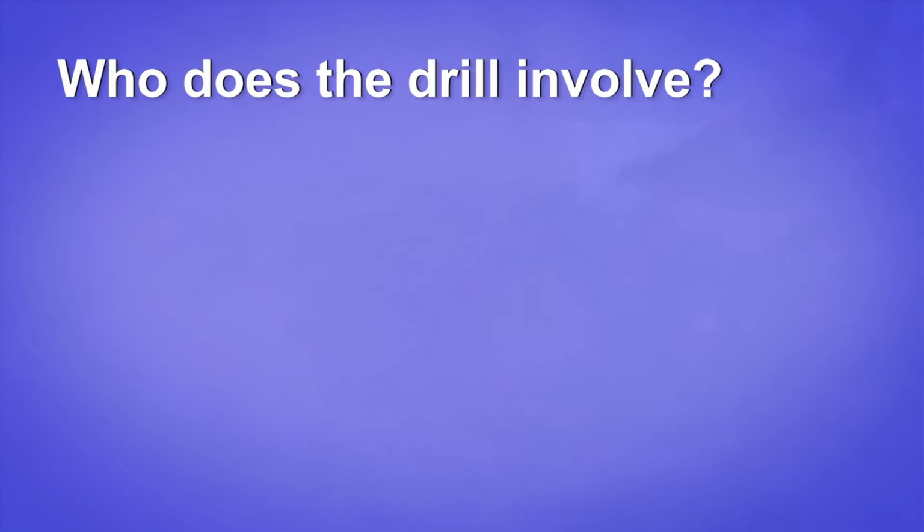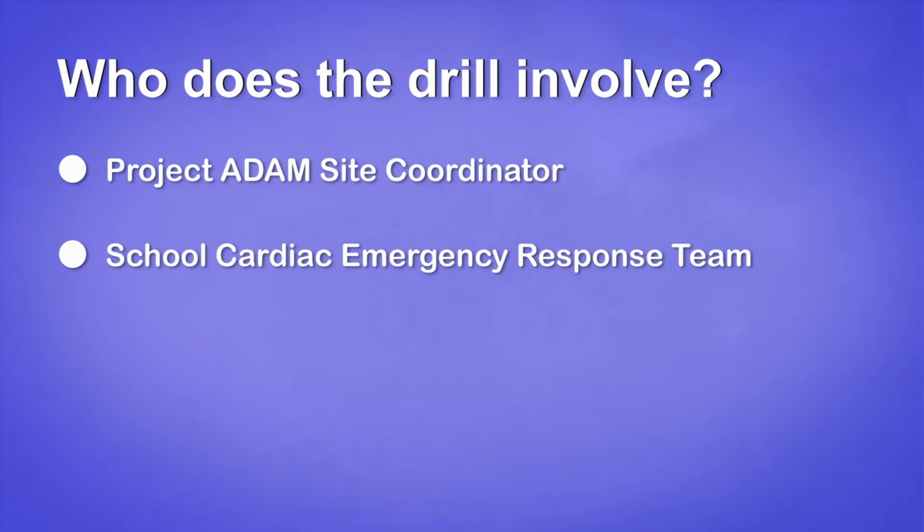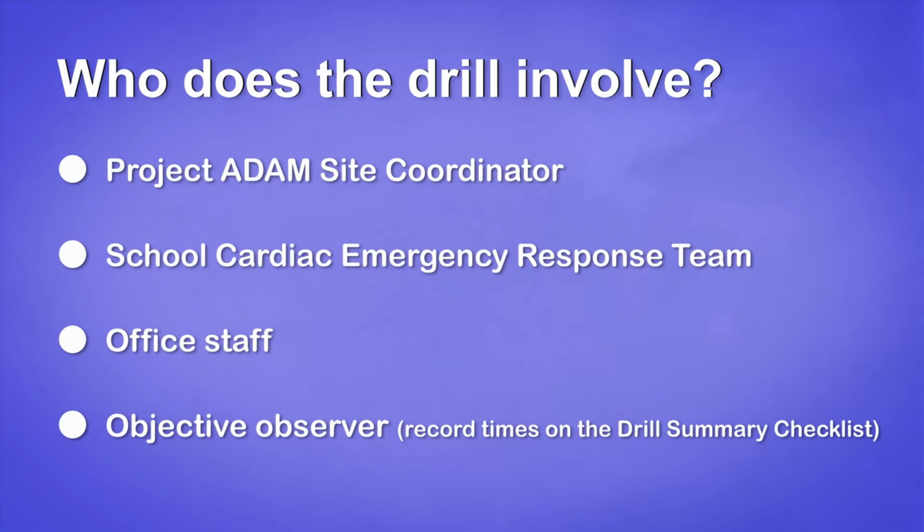Who does the drill involve? Project Adam Site Coordinator. School Cardiac Emergency Response Team. Determine if classes need to be covered during a drill or true cardiac emergency if classroom teachers are on this team. Office staff. Objective Observer, to record the times on the drill summary checklist.